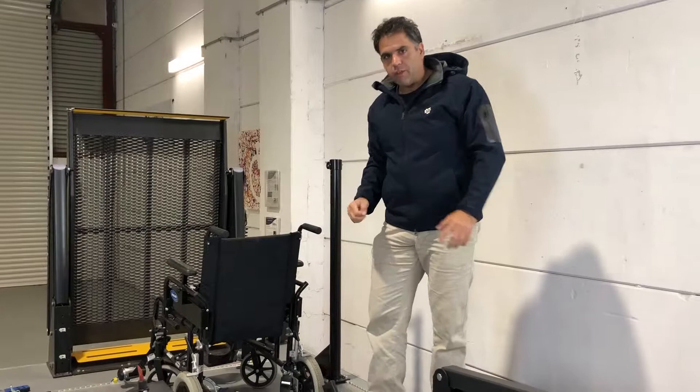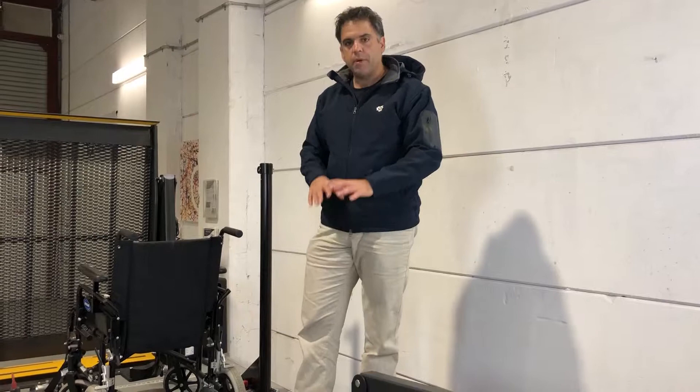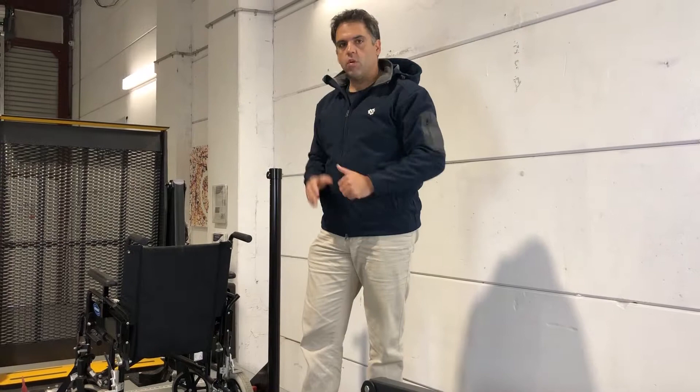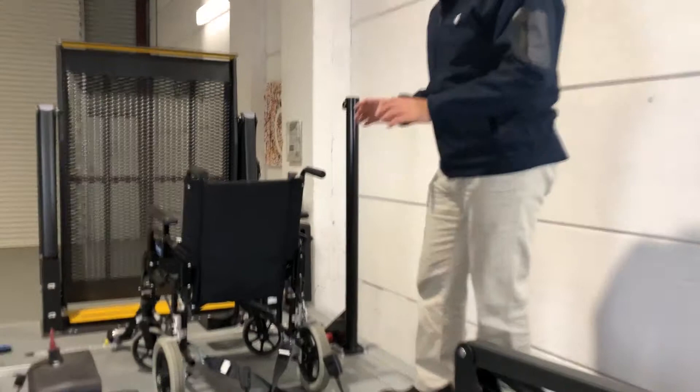Last but not least - and this is actually probably the most important thing - is the instructions and guidelines of the restraints. This applies to every single restraint from every single brand. We've got Unwin here, but all other brands on the market say the same thing: you must go in a straight line straight to your wheelchair, and you must have the right amount of tension. You must never ever crisscross. If we follow the instructions, that's when we're doing the right thing and following the laws. If we don't follow the instructions, we could potentially have liability issues and legal cases on our hands. So the instructions always say go straight.